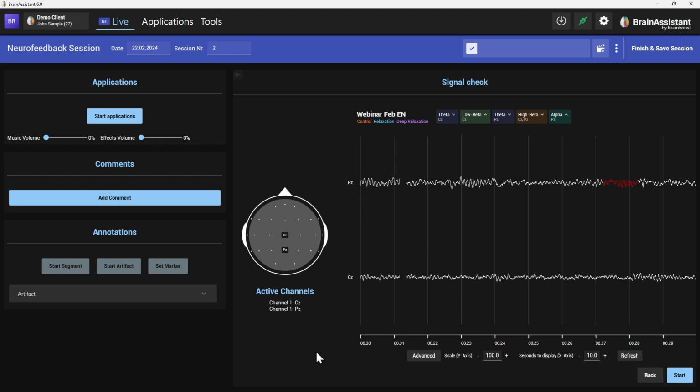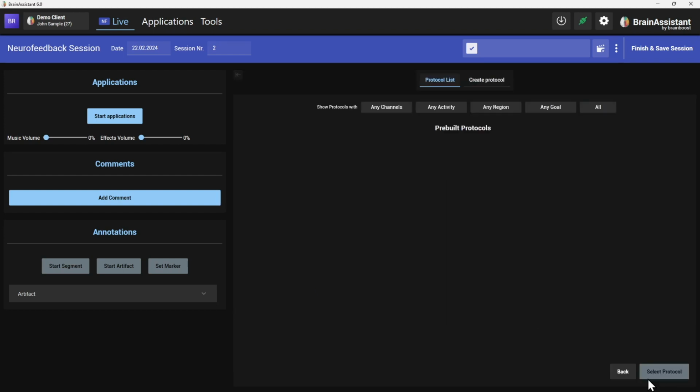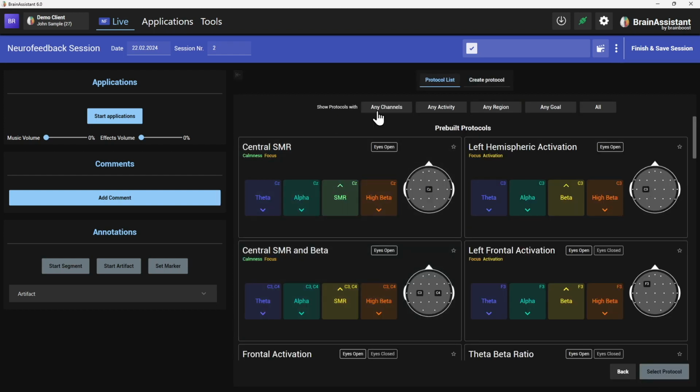You can just try it out. How can you try? You can place the electrodes, and once you place them on the head, you just fool around, for example, with channel one. So, for example, with Pz, you see where this huge bad signal arises. So you know, okay, I placed the wrong cable in the right position. This is how you're going to find out as well. But in your version, this will work just fine.